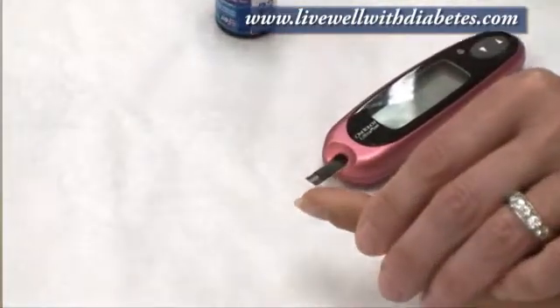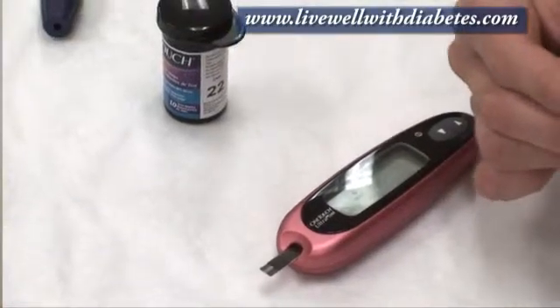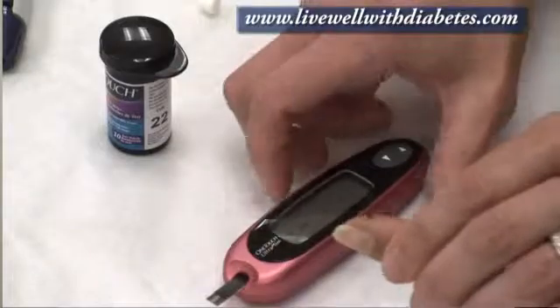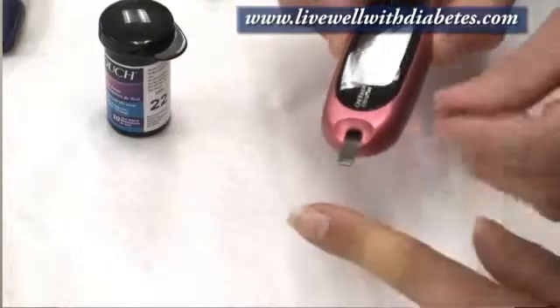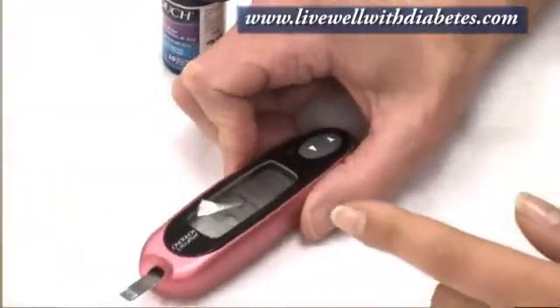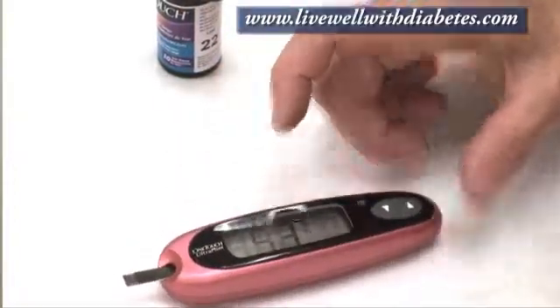Pull the lancet away. Then push the blood up towards the hole. There's the sample. Now we just touch the drop of blood to the end of the test strip. The blood sips in automatically. Then it automatically counts for five seconds and at the end gives you your blood test result.